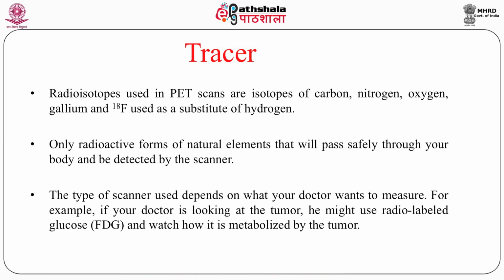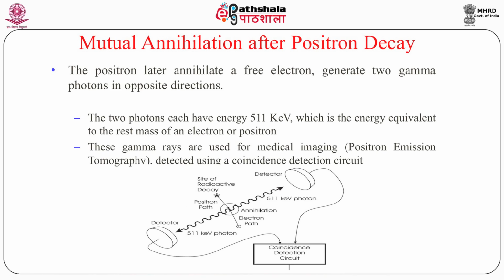The cells won't understand that the glucose is not normal glucose, but the tracer is fluorine-18 here. This goes inside the body, the fluorine gets trapped, glycolysis takes place, and it comes out in the form of water, and this fluorine-18 emits the positron, and that is what we want to make the photons for detection purposes. If you see the clear picture over here, the two detectors around us, the same kind of detectors are there all around the body.